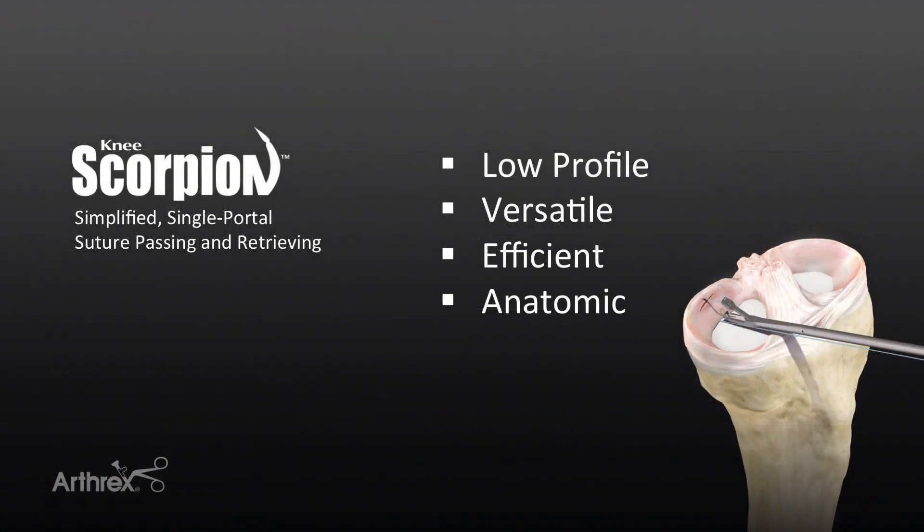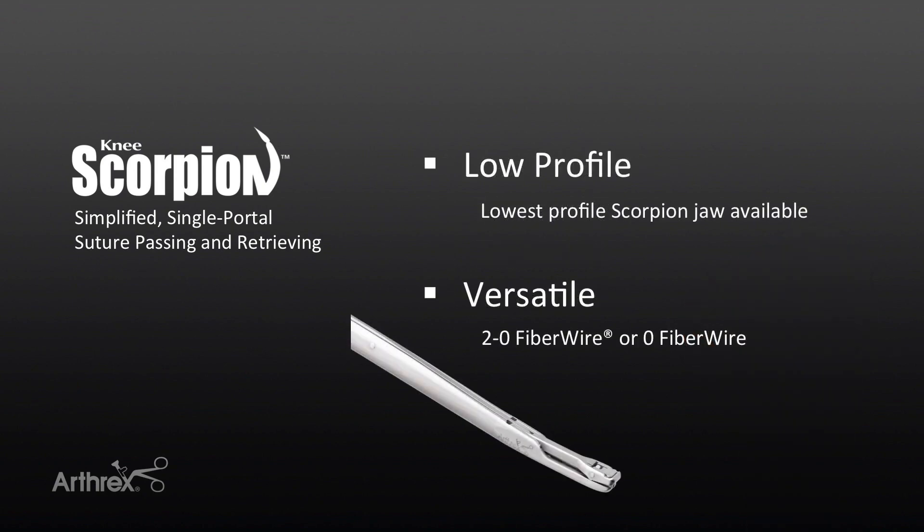I'm going to demonstrate the usage of the Arthrax Knee Scorpion, a reusable all-inside meniscus repair device. This device allows one-handed operation by passing sutures through the meniscus and then performs self-retrieval of the suture tails. It has a low profile allowing for passage into tight spaces in the knee. The jaw is 3.2 millimeters in depth and 4.6 millimeters in width, and it is designed for passage of 2-0 or 0 FiberWire suture as per surgeon preference.